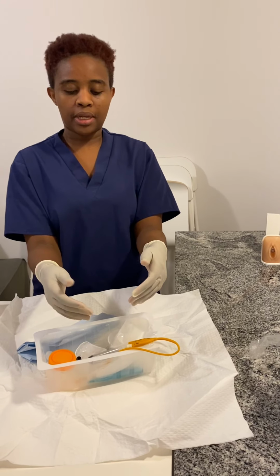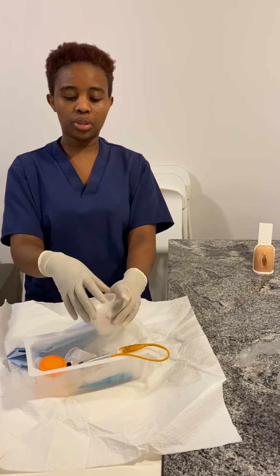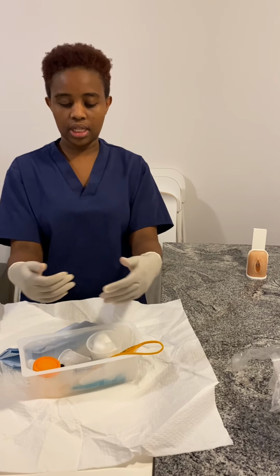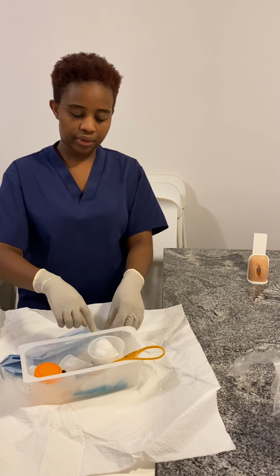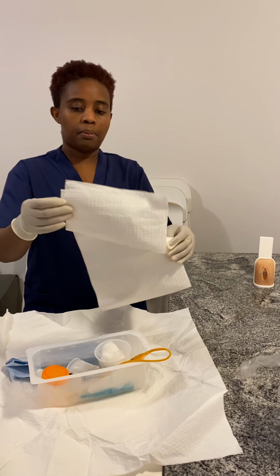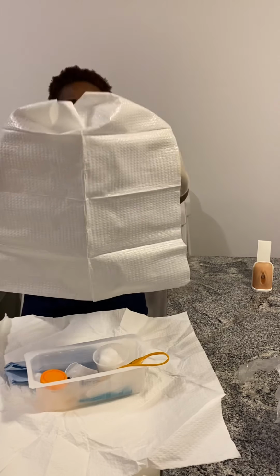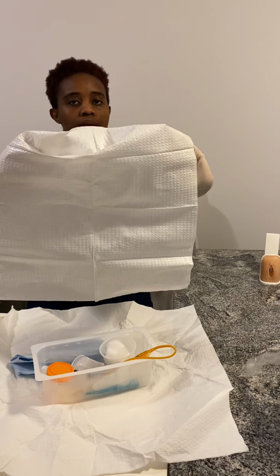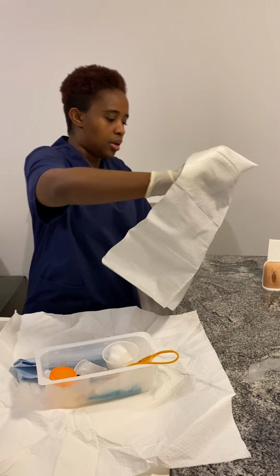So I'm going to use the betadine solution to soak into the cotton. I'm going to use this cotton to cleanse the urethra before inserting the catheter. So what I'm going to do now, I'm going to use the drape and press it on the bottom. I have to make sure that when I'm unfolding it, I do it very slowly to avoid any contamination. And when I'm pressing it down, I have to make sure that my gloves are not contaminated. They have to still remain sterile.